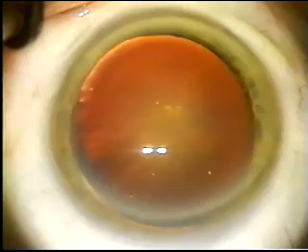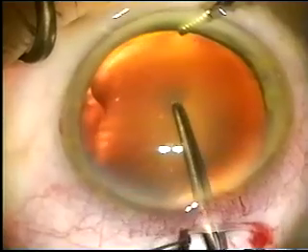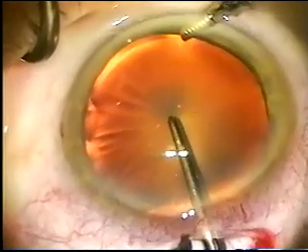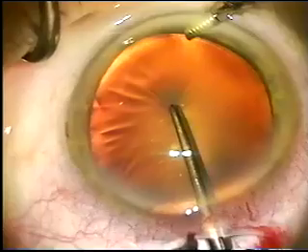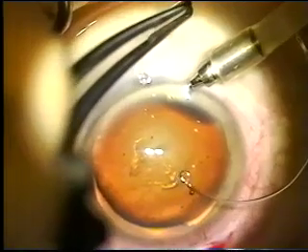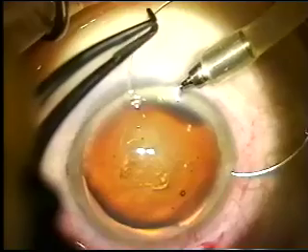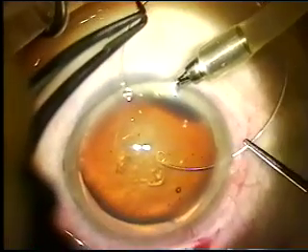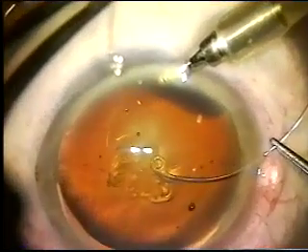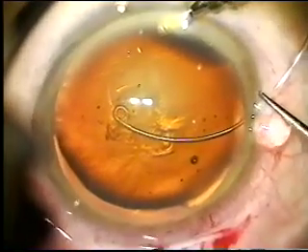In this traumatic cataract, you can see the lens is decentered inferiorly and moves excessively with attempted puncture of the anterior capsule. A sharp instrument was used to start the capsulorhexis. It was completed without difficulty, and in this situation we are threading the endocapsular ring through a paracentesis, again pushing toward the area of zonular dehiscence.